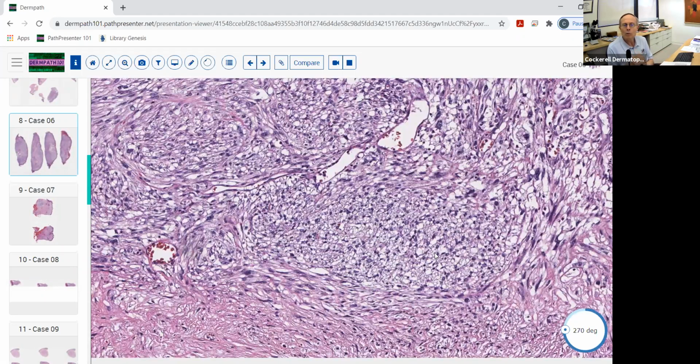The differential diagnosis includes three classic entities histologically in dermatology. Now, if you get into soft tissue pathology, there may be more, but from our perspective, what I use every day when I look at these, the main differentials are malignant melanoma, which can do this on occasion, squamous cell carcinoma that becomes poorly differentiated, and then this lesion, atypical fibroxanthoma. So those are the three.